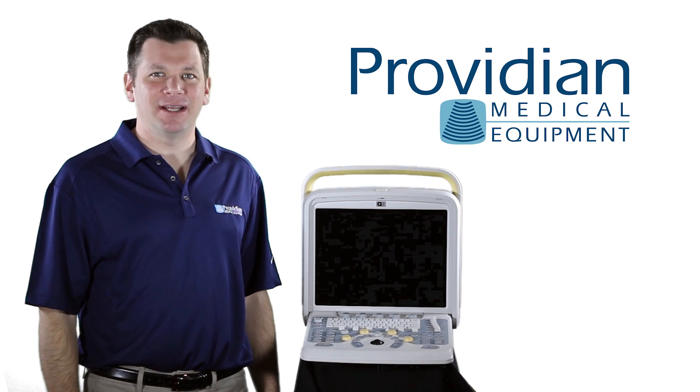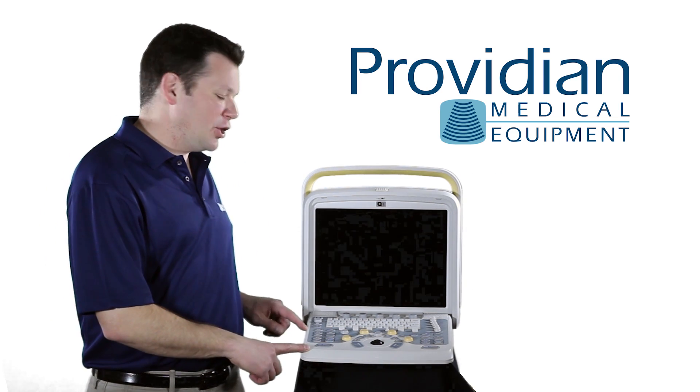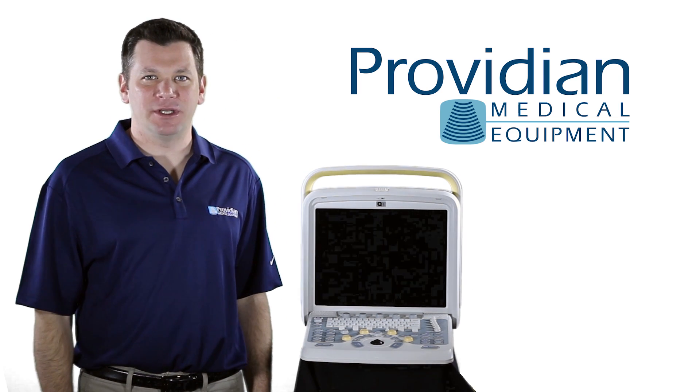Hi, I'm Brian Gill with Providian Medical and today we're looking at the Chison Q5 portable ultrasound machine.